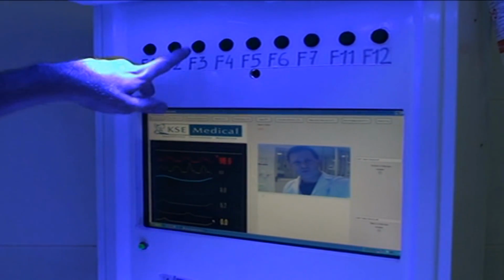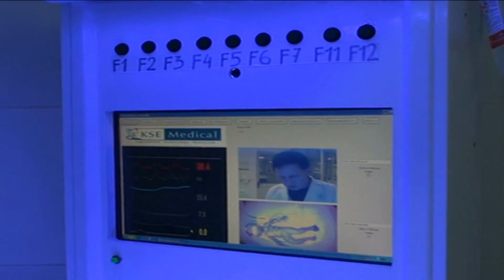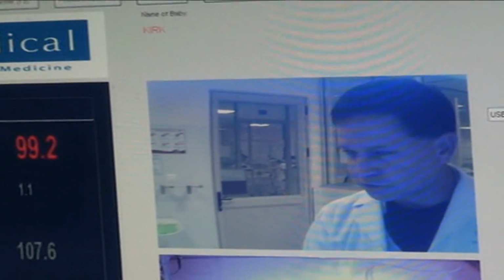When you're done with that, you can hit the save resume button, come back to the place you were with all of your alarm settings and everything saved. BabyStation is designed so that you can do research and learn how to do a procedure and still come back and do the work that you're doing. So those are all set up.